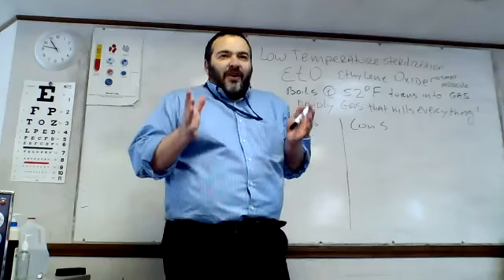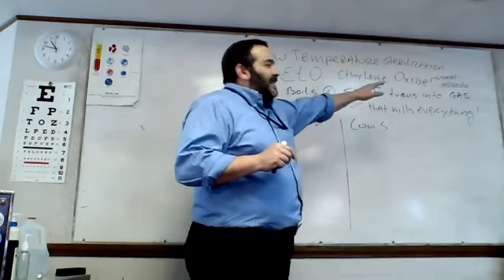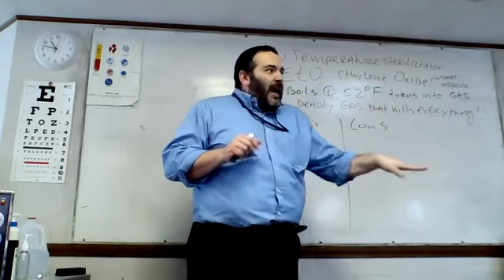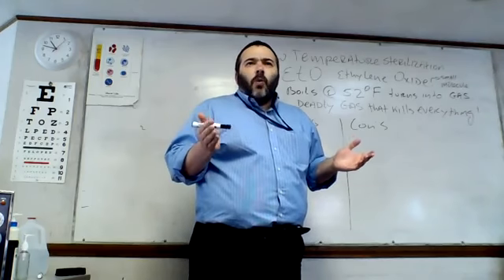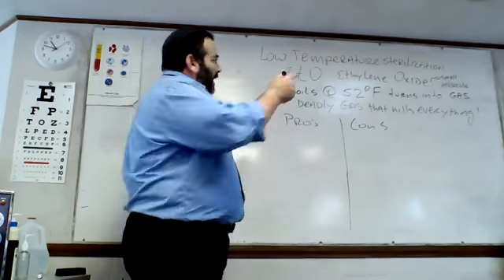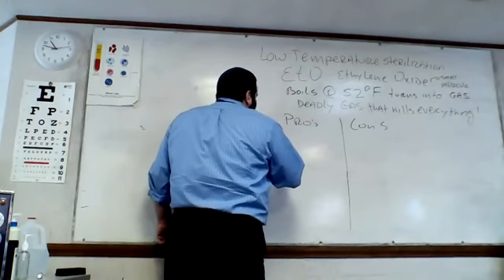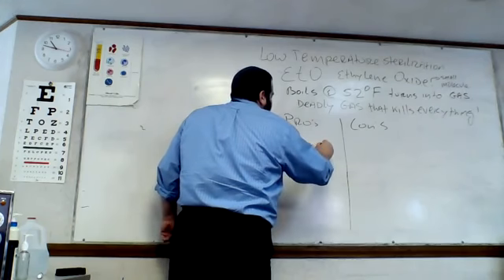Oh, that's right. You can fit into everything. Okay, now we're getting somewhere. So it's a small molecule that's able to get into everything. Fantastic. So why is that good? Because it's a small molecule, it has excellent penetration.